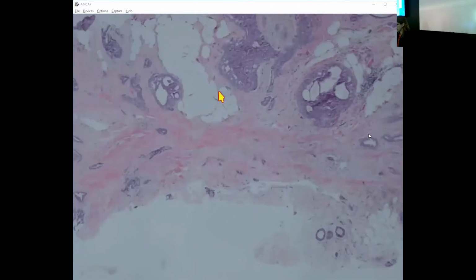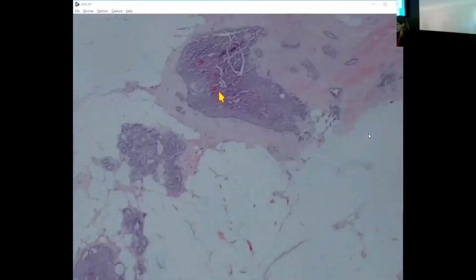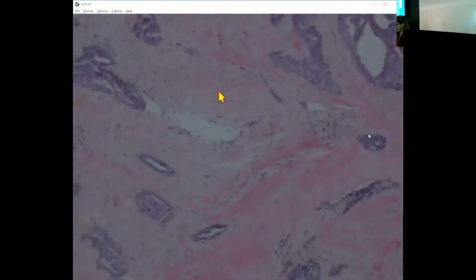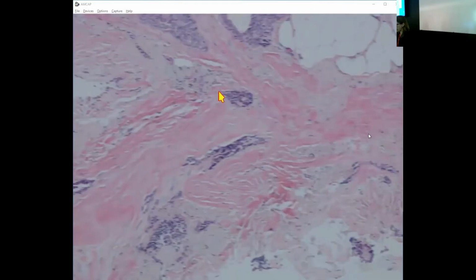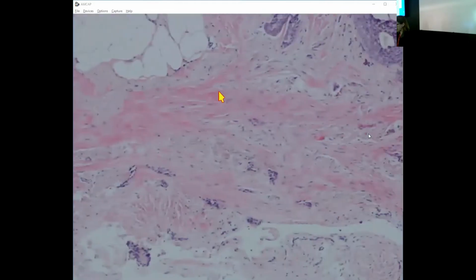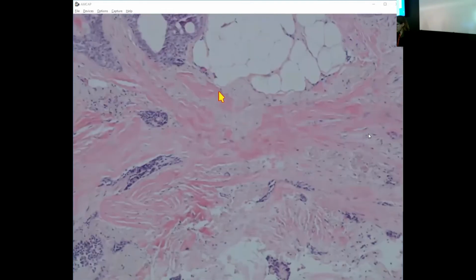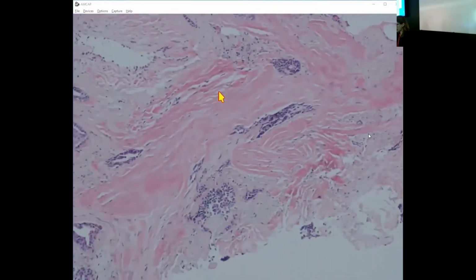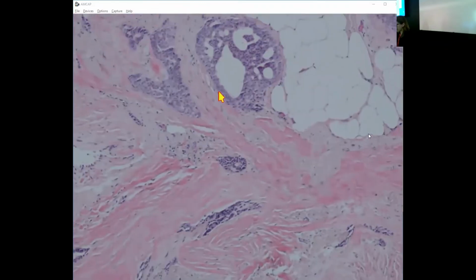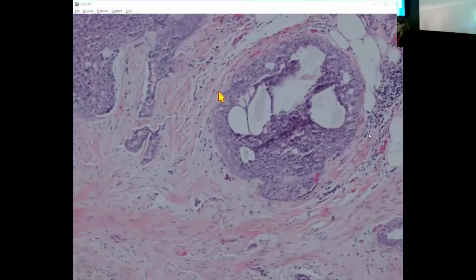Okay, I see again stellate morphology. What do we think about the stroma on low power? Elastotic stroma. Yeah, some elastosis, maybe some fibrosis and sclerosis as well. Yes. Maybe some foci of usual ductal hyperplasia. Yeah, so I think that's exactly right. So I agree with you.